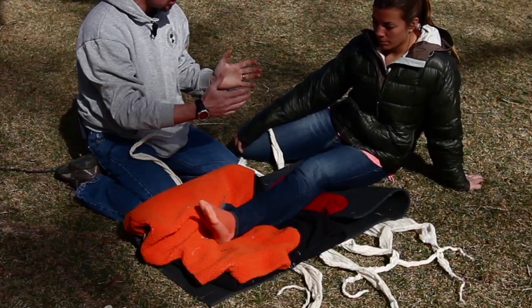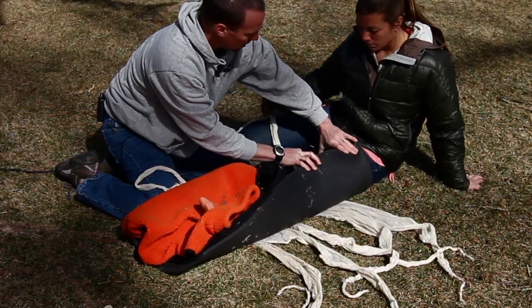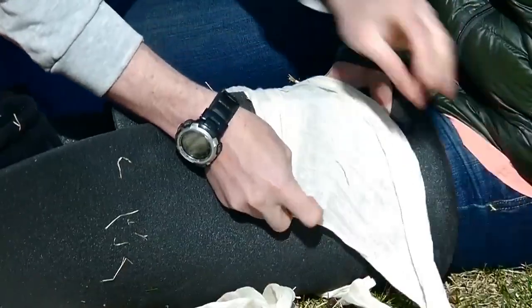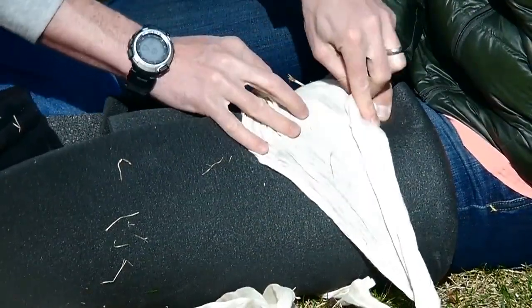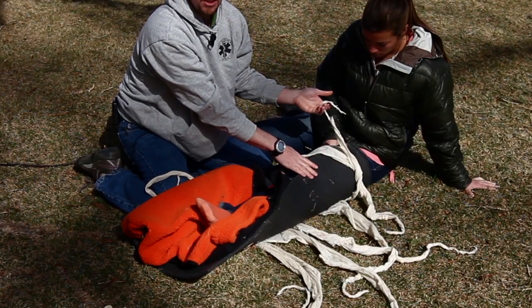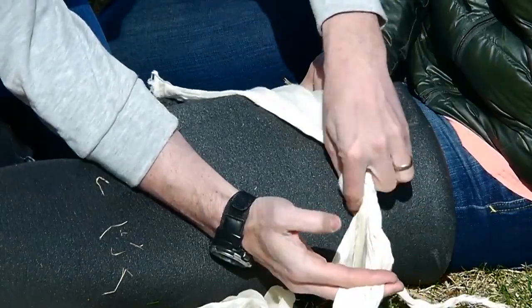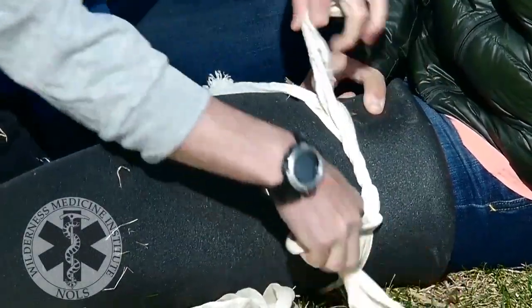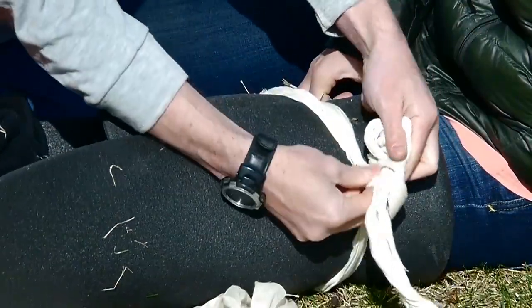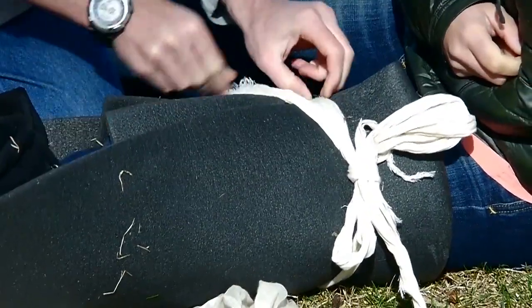Now I can start to secure my splint to create some of the rigidity that comes with compression. Jordan, would you mind putting your hand up here for me? When I tie my cravats over my patient, I'd like to make sure that any place the tie-off comes over tissue is nice and wide, so that I don't create any localized tissue pressure that could cause more injury. I can start off with a standard knot, and if I wrap it around one more time, I've created a surgeon's knot with a little extra friction that can be pulled fairly snug. It's still adjustable — I can tie my bow so that as my patient needs the splint adjusted during evacuation, I can come back and do so.